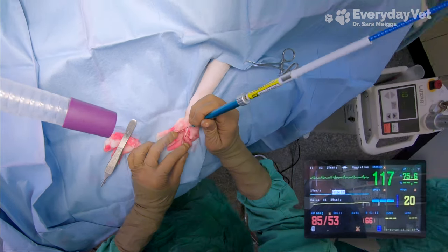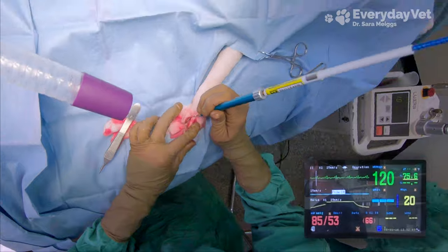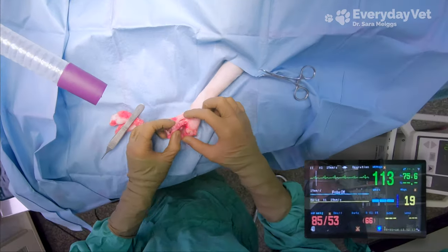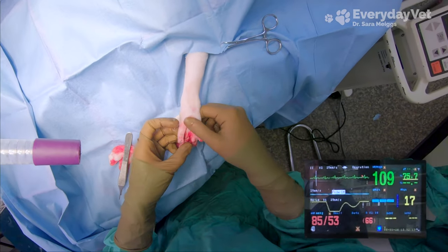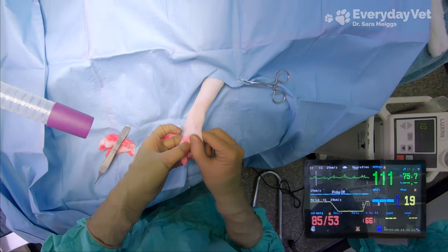I'm really happy at this point that our efforts to increase the blood pressure have worked and he's no longer hypotensive. He's now at 85 over 53 with a mean of 66, and the heart rate is even staying above 100. So even though the blood pressure is still at the lower end, we do have some wiggle room just in case the assistant ends up having to increase that sevoflurane.